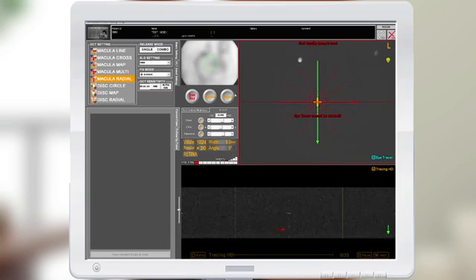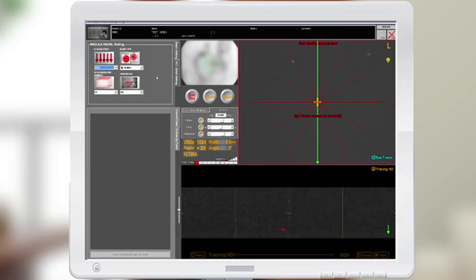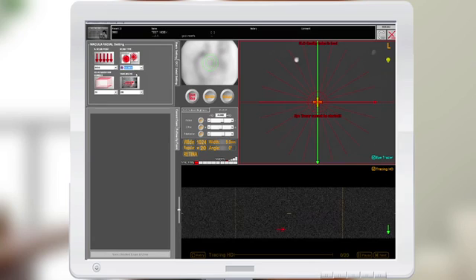The macula radial scan defaults at six lines and can be adjusted out to nine millimeters. Under the detailed settings, you can select 12 lines.